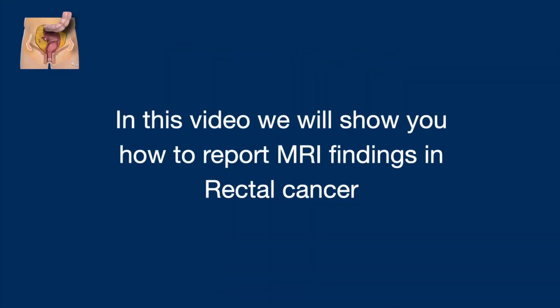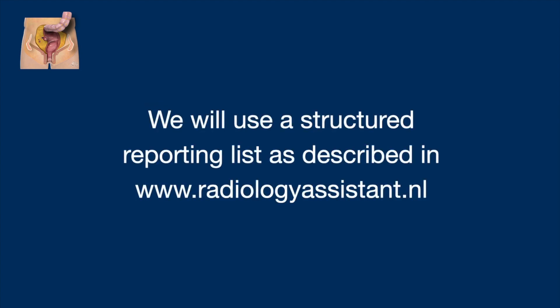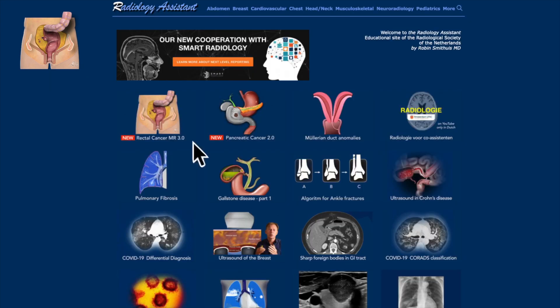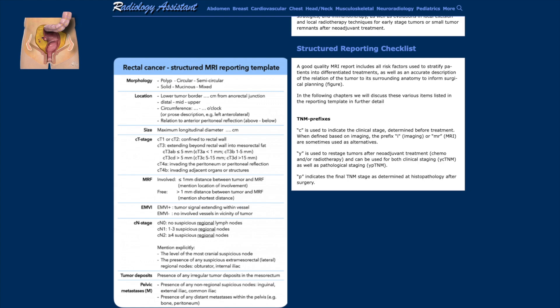In this video we will show you how to report MRI findings in rectal cancer. This rectal cancer is located in the high or upper rectum and we will discuss the relationship to the sigmoid, mesorectal fascia, and peritoneum. We will use a structured reporting list as described in the radiology assistant — go to the website, click on rectal cancer, structured report list, and there you have it.